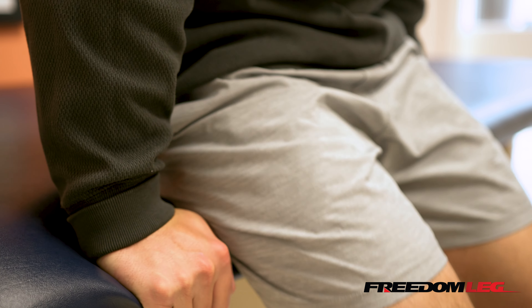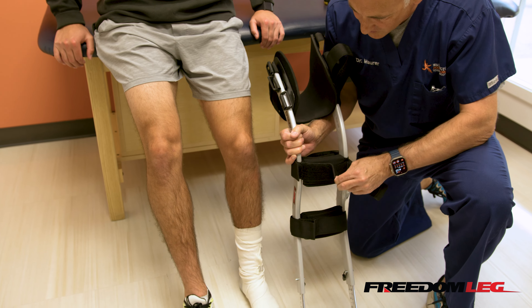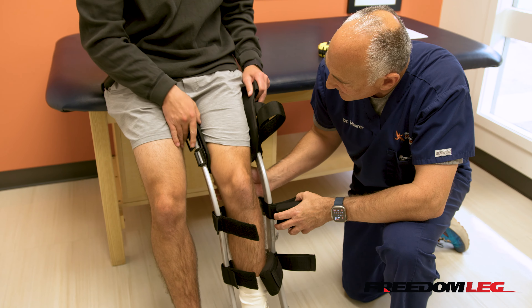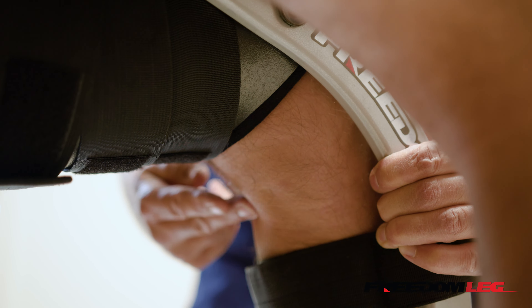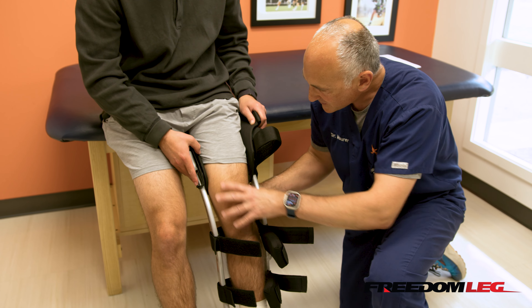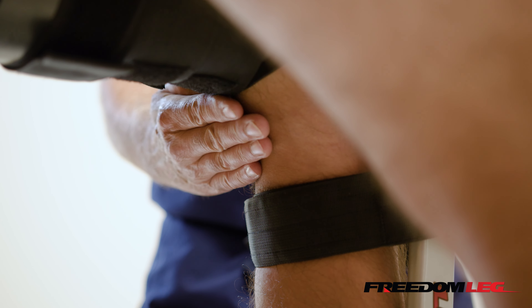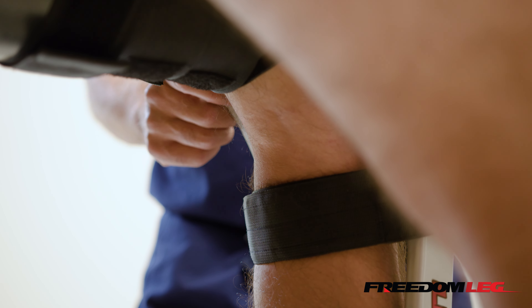Now we're going to have Bodhi slide forward on the table so there's room to fit the brace. We're going to undo the Velcro, move it out of the way, and he's going to drop his leg in from the top. Everybody feels a little bit differently — I fit mine right into the crease in the back of my knee, but Bodhi likes his a little higher. It depends on where the musculature of your leg is, and everybody's got a slightly different shape. Pay attention to the distance from the posterior knee crease to the edge of the thigh strap — measure it with your fingers. This is four fingers distance, and that'll help you get a consistent, reliable fit every time you put the brace on.